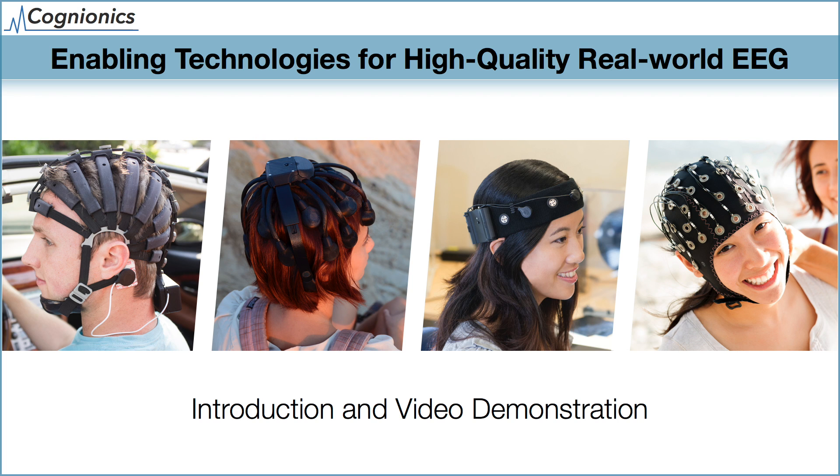This video is an introduction to some of the enabling technologies used in Cognionics EEG systems. We'll do a brief walkthrough of some highlights and conclude with a series of video demonstrations.